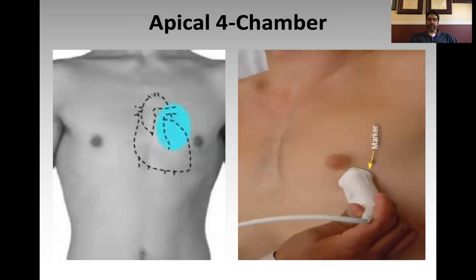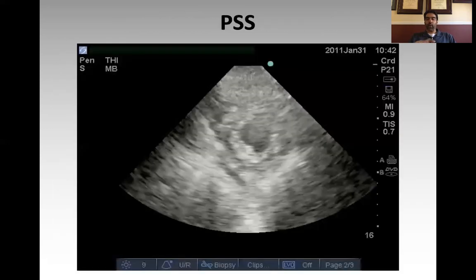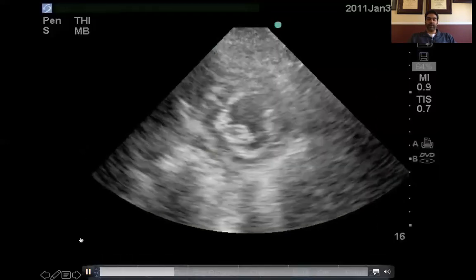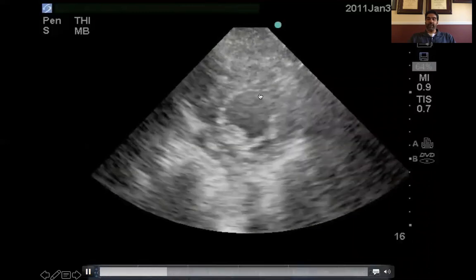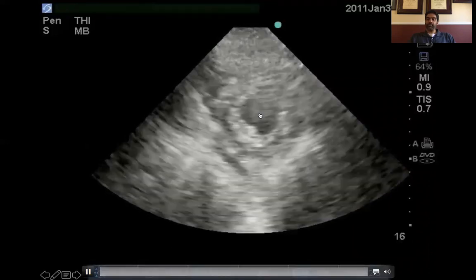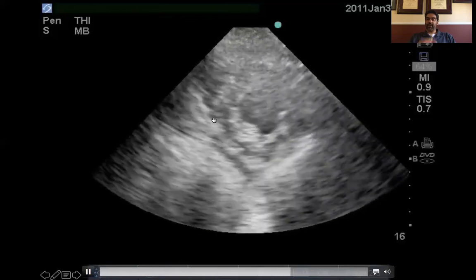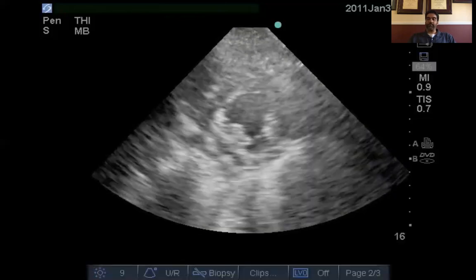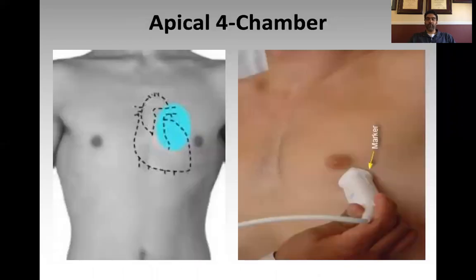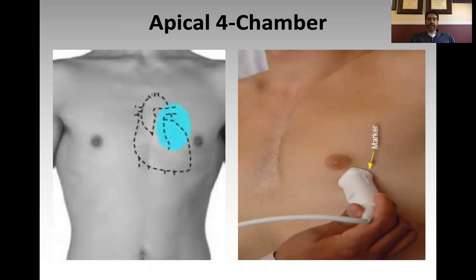The next view is the apical four chamber view — this is your money shot, because you get more information from this single view than from any other. Before moving on, I should mention that the parasternal short axis view has two main clinical uses: assessment of LV function, and assessment of septal shape and septal motion — which is the best view for that. We'll discuss why that matters when we cover the assessment. Now, the apical four chamber: the idea is to put the probe at the PMI and slice up through the heart.